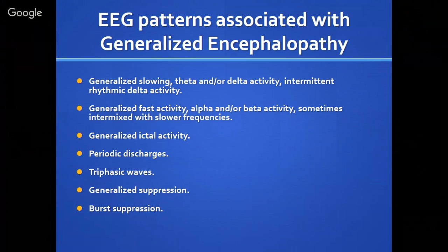You would think that alpha is normal, but patients who are comatose may have alpha. There would be an alpha coma or alpha theta coma, even beta coma, right? So I'm talking about all these different names, but the students, do you know? Did we talk about the ranges last week when we were there briefly?